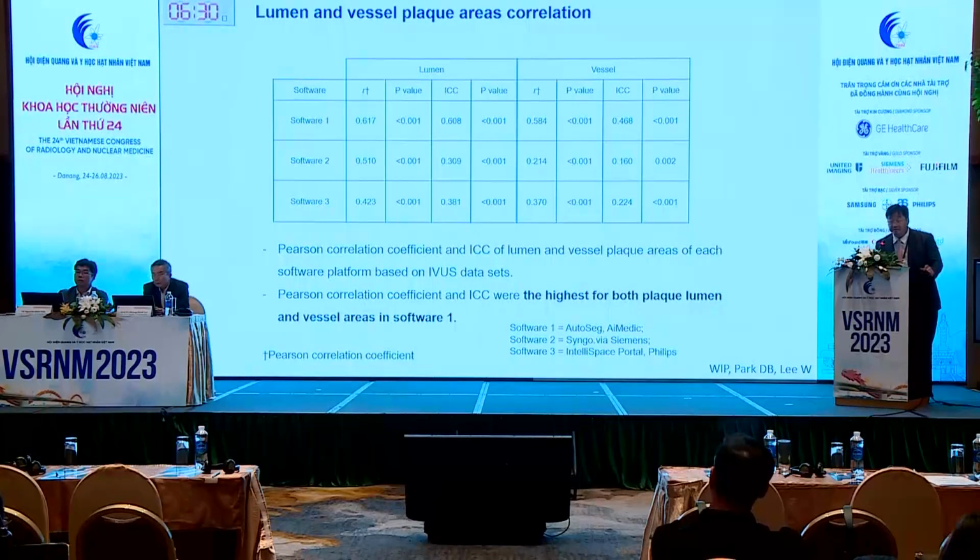So this is some of my research about coronary artery segmentation, a new concept that is the location adaptive threshold. You can apply this method when you read coronary artery CT angiography scans, because you have to know that a small vessel has a low attenuation with the same concentration of contrast media in it.